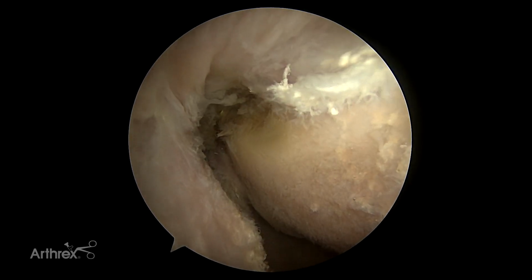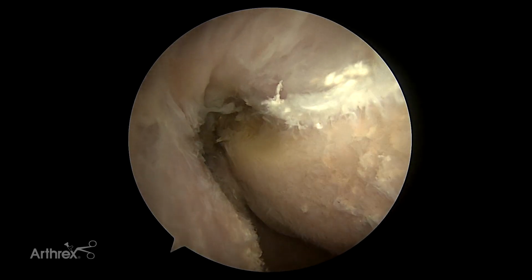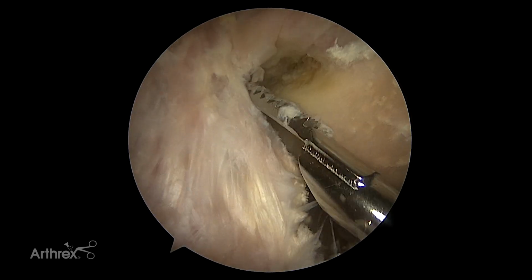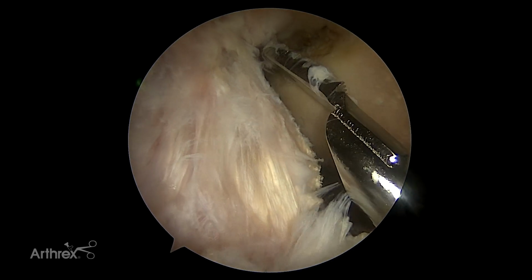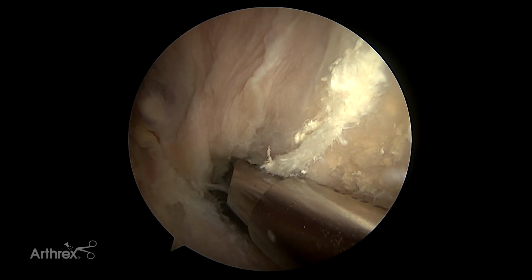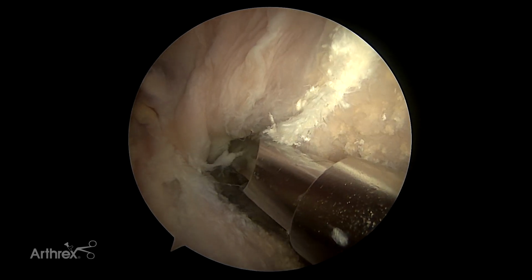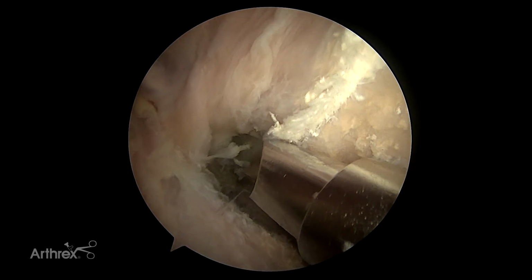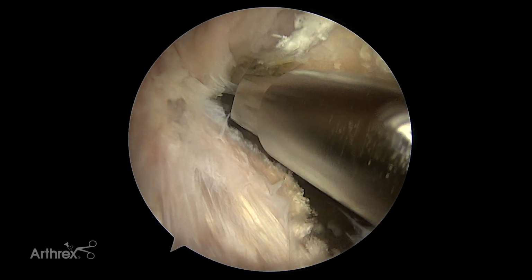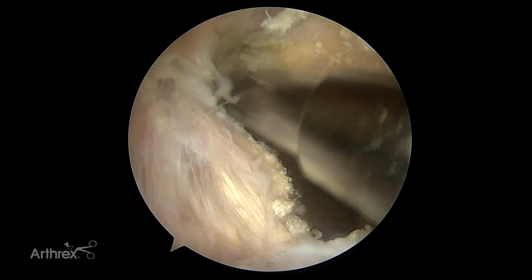So now we're going to take the PoweRasp, and it is a nice linear oscillating rasp that goes on the standard shaver handle that works in a forward direction. You'll see the blades as we bring them into this enlarged portal. You can see the teeth are in one direction. So here we're going to work on the wall first in a forward mode, and then literally can go back and forth and just pretend it's like a Dremel tool and just kind of PoweRasp this bone off in a very controlled setting. So it's got enough space between the shaver sleeve and the rasp to create extraction of the bone products that we're removing.